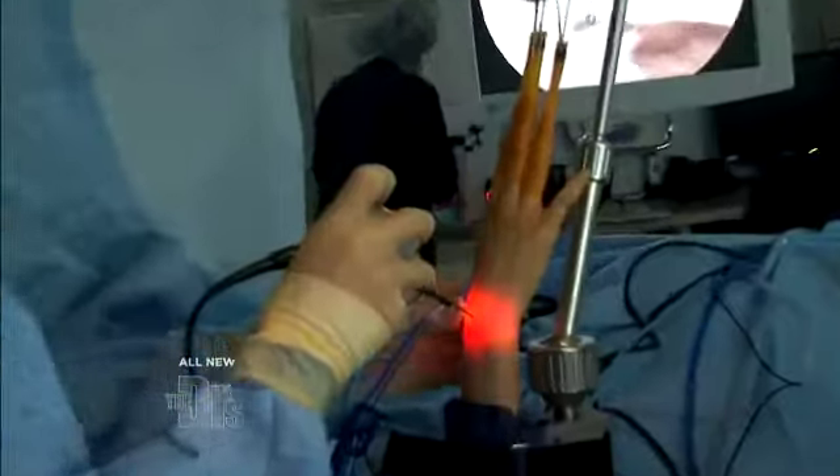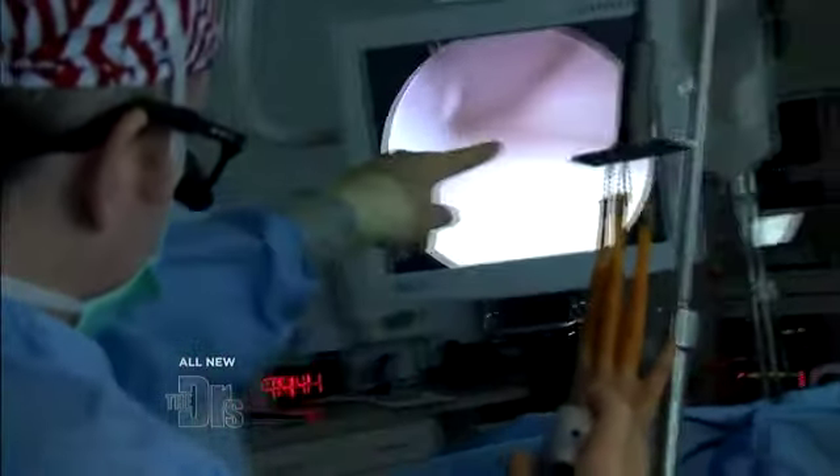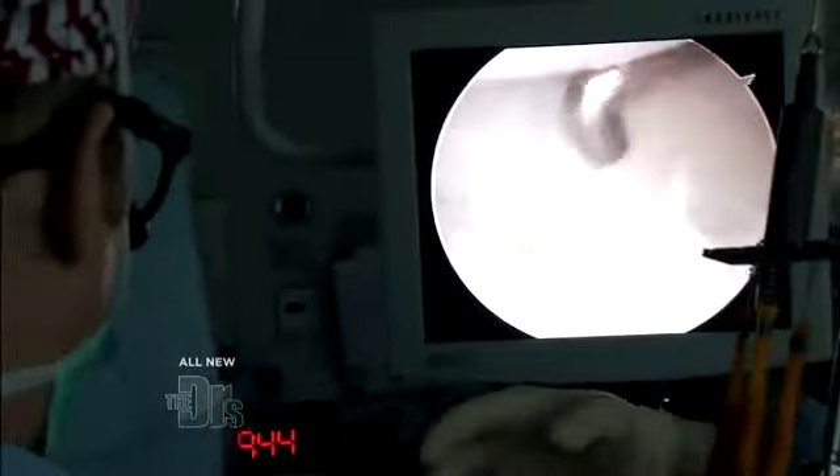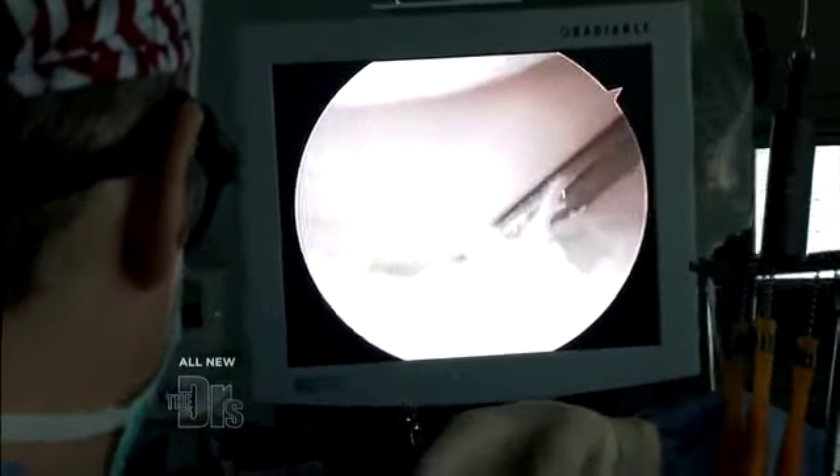Light on please. That's the end of the radius bone, or the forearm bone. You can see right there the edge of the tear — it's flipped up right here. Normally it attaches right along here.